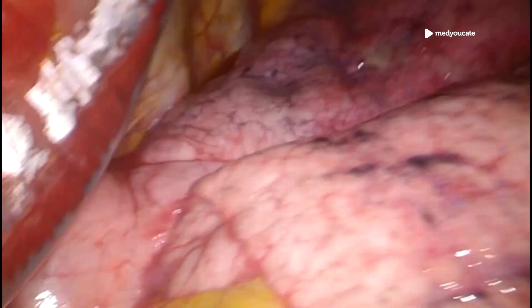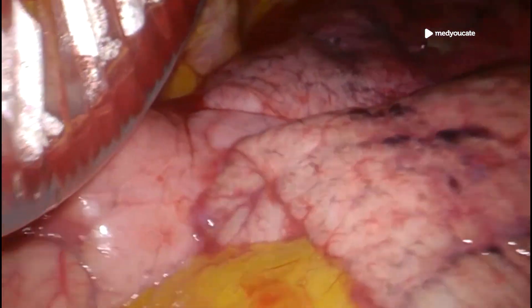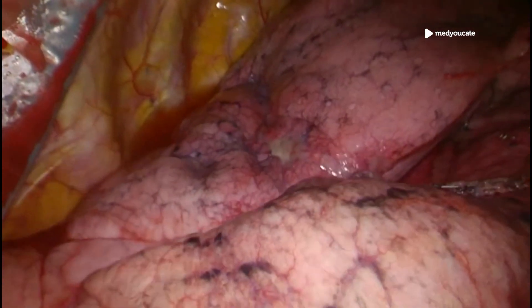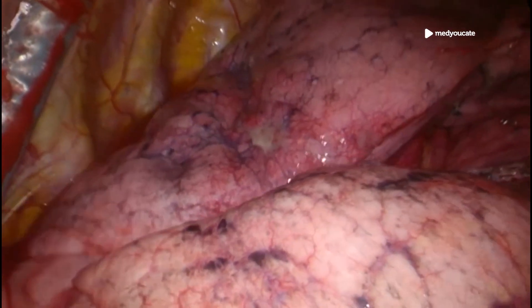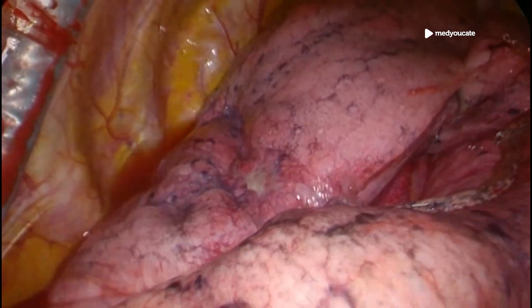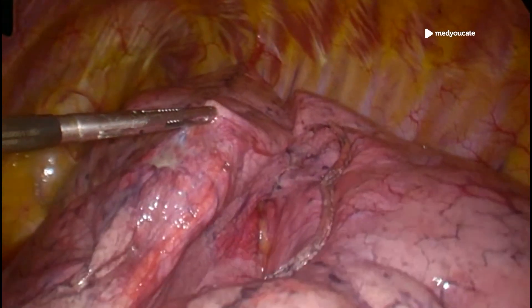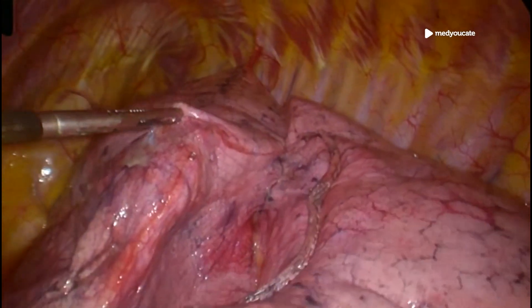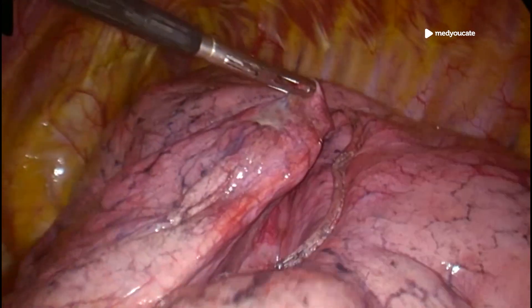Now, if we look carefully, we see that there is another white lesion which also has to be removed. This one is located on the left upper lobe bottom segment. So we basically repeat the procedure.